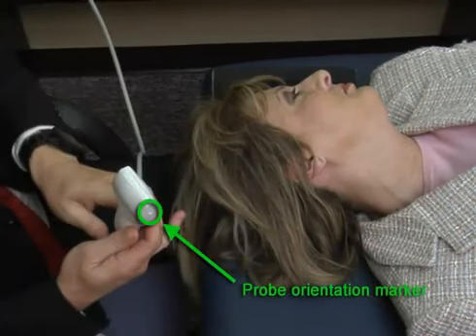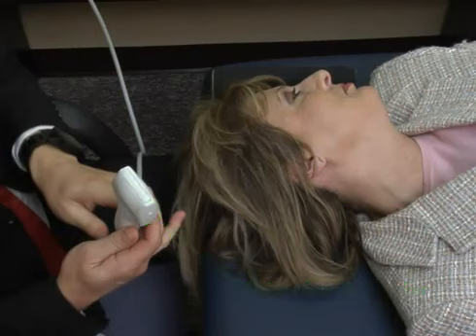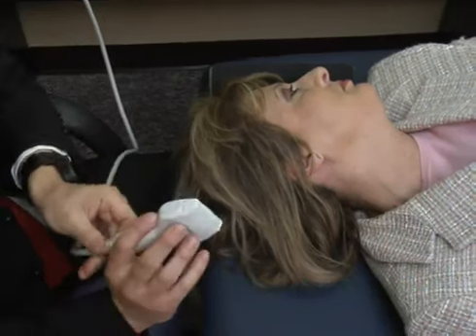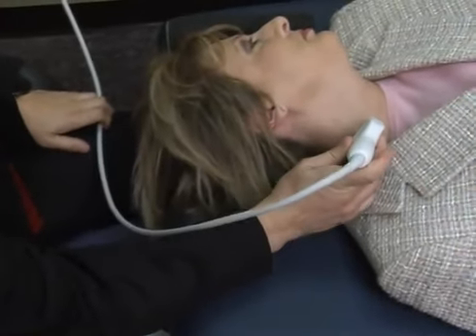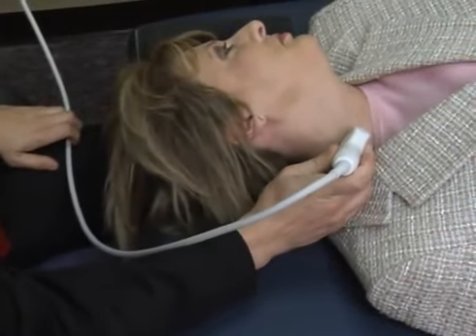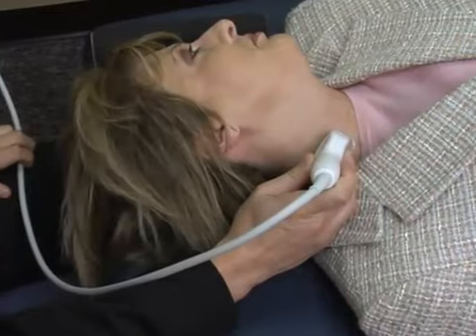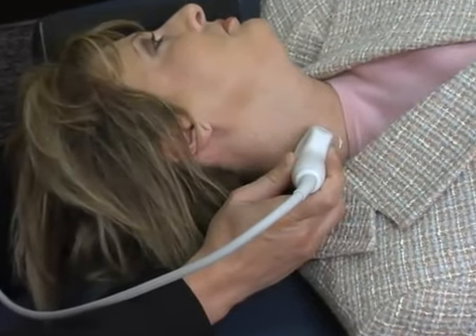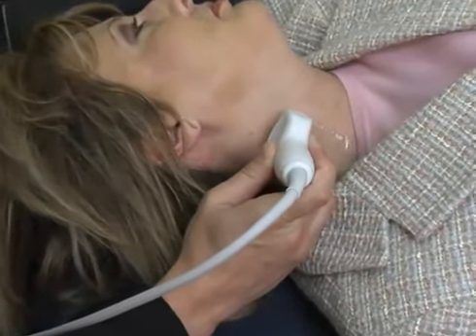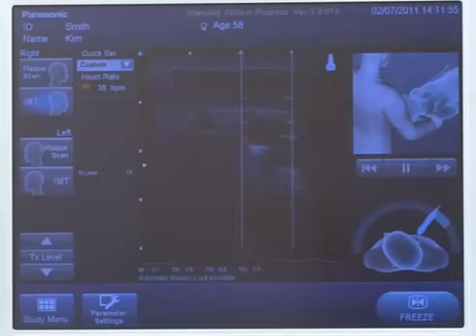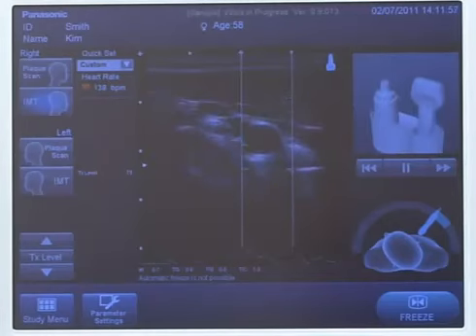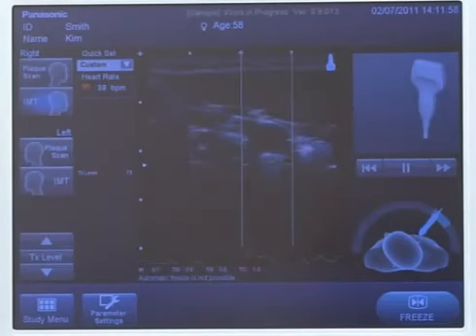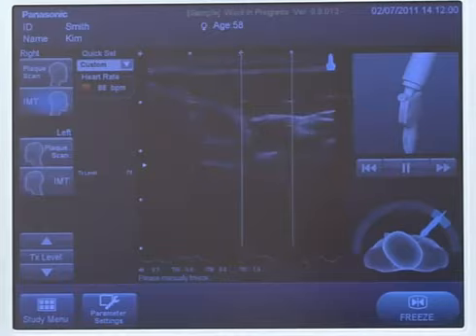The probe orientation marker should face the patient's back, or facing the bed. Begin the exam in a transverse orientation at the base of the neck. Begin the plaque search by scanning up the neck in a transverse view. The carotid artery, which appears pulsating, should be in the center of the screen.